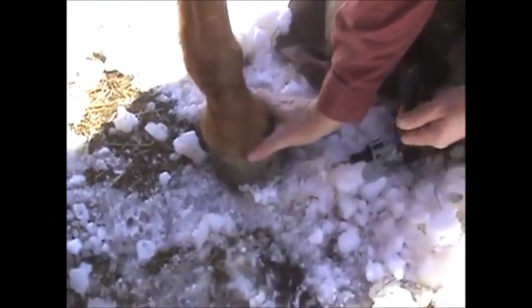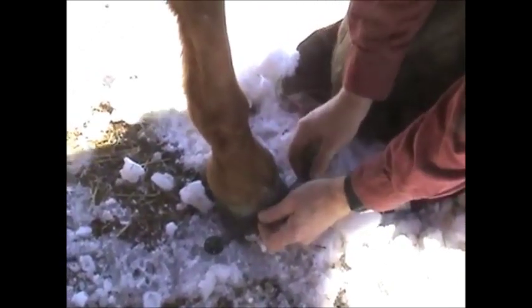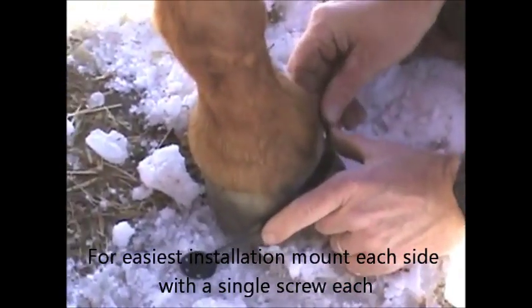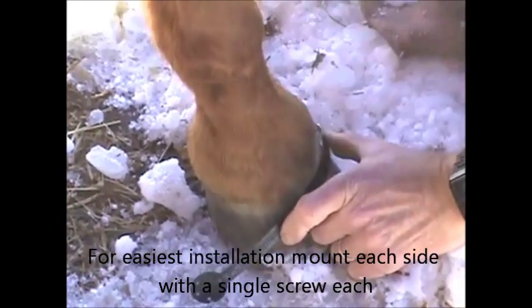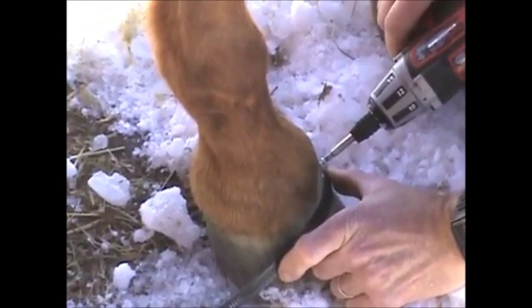What we're going to do is find the placement for the band first. You usually want about an inch below the coronary band. I use my thumb to find the spot, and then we find the placement for the side and put the first screw in so I can get hold of it.